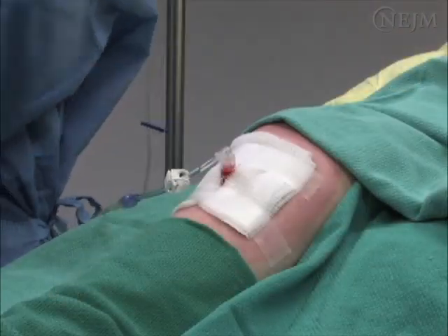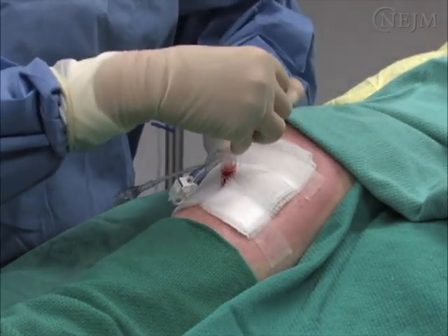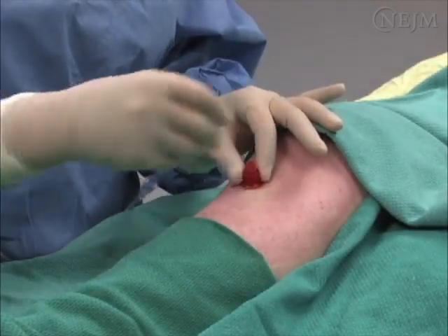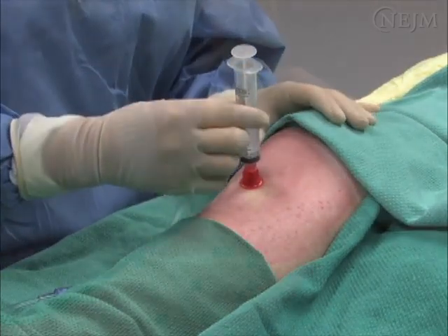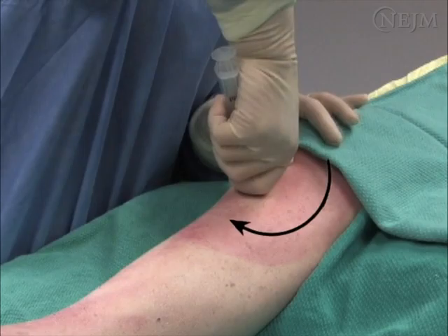The needle and tubing should be secured to the leg with tape, and the leg should be immobilized to prevent dislodgement of the needle. To remove the catheter, disconnect the intravenous tubing and attach a sterile syringe to the hub. Stabilize the leg and gently pull back while rotating the needle clockwise.